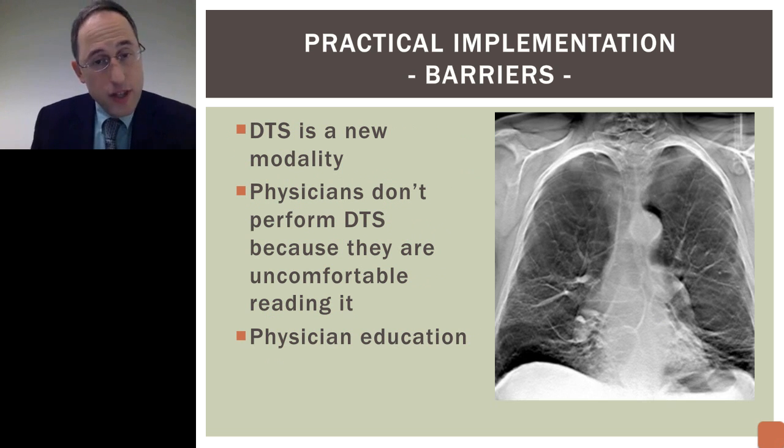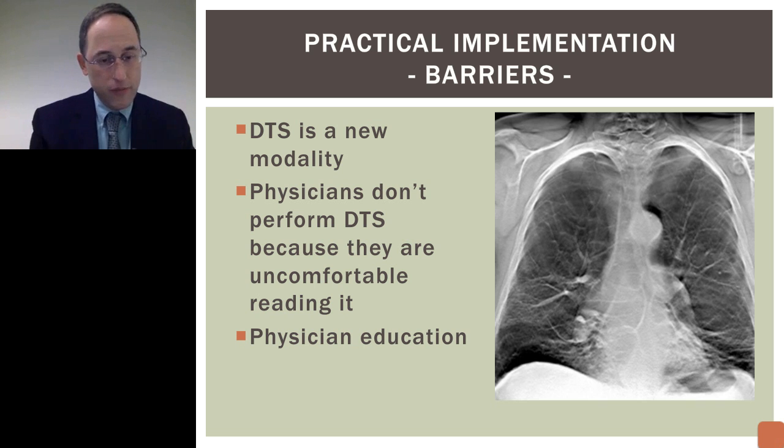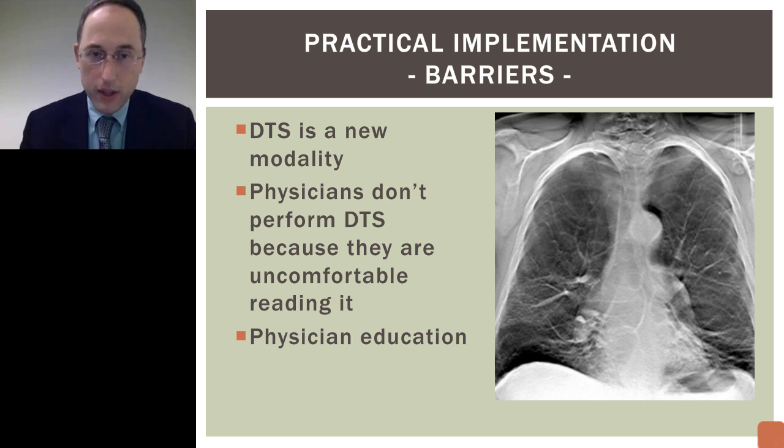So, barriers to implementation. Tomosynthesis is a new modality. Physicians don't perform it, in my opinion, many times when they do have it, because they feel uncomfortable reading it. Right? And I think the way around that is just physician education, and maybe start by doing things in parallel, doing chest X-rays with tomo, so that they have the other modality there to sort of confirm their findings and help them with their comfort level.